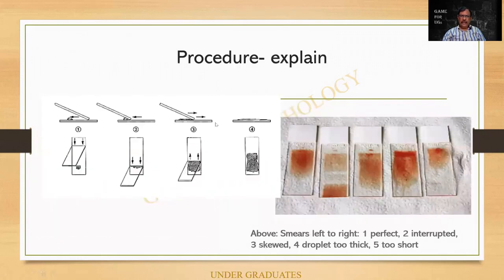So this is again explaining the procedure. You people will have to explain this. In fact, it is not so simple to make a smear. This is what I mentioned earlier. I pull a drop over here, pulling it backwards, it spreads by capillary action. Again, pulling it forward so that a smear is made. And the same thing is shown as a head-on or aerial view.